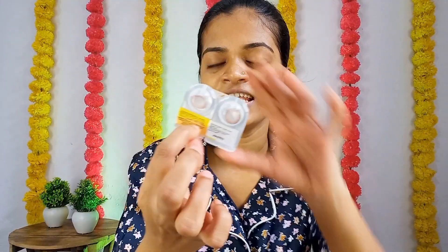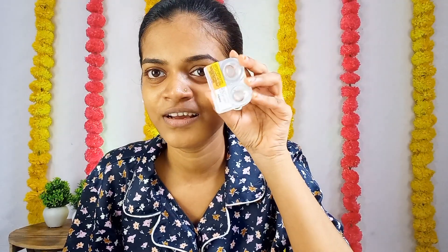You can see it here — it comes in a case. I was planning to do a proper bridal, heavy makeup look along with the lens wear, but let's just focus on putting the lens in first.